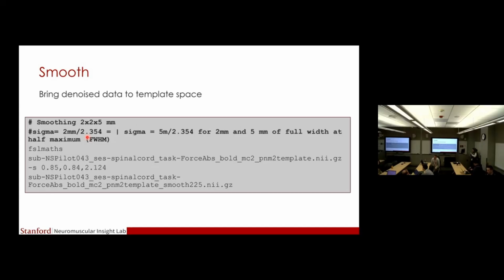That's what we were talking about during your talk, like we're trying different voxel sizes. Yeah, and we want to do one by one, but because we also want to do multi-echo, that will make it impossible. So, yeah.